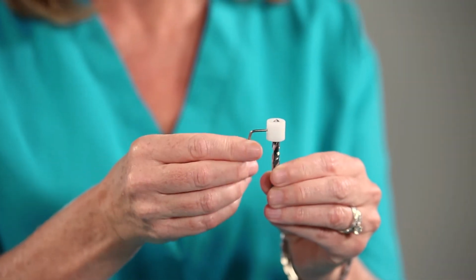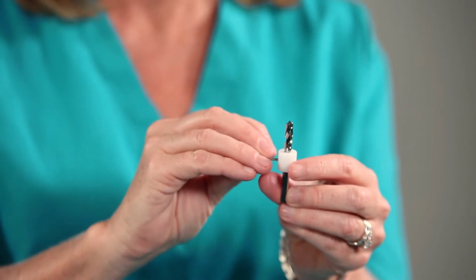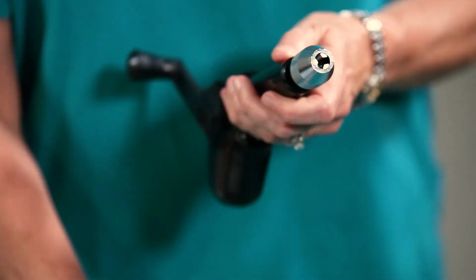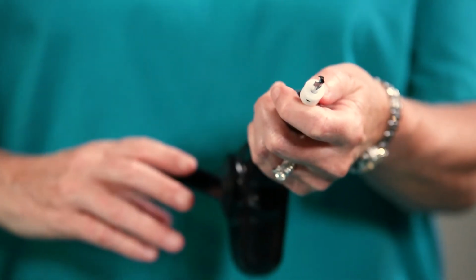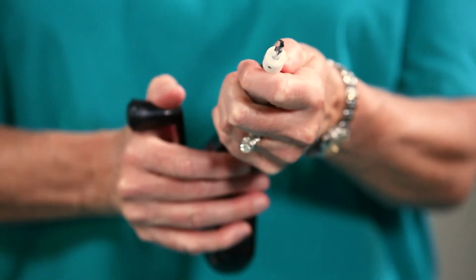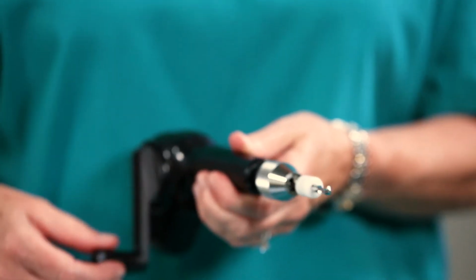Locate the desired drill bit and determine the penetration depth, then tighten the depth guard with the hex wrench. Place the desired drill bit into the drill and tighten. Ensure that the patient is appropriately anesthetized and sedated.